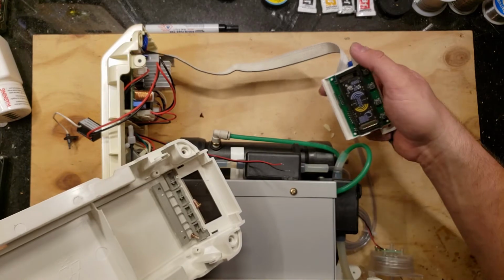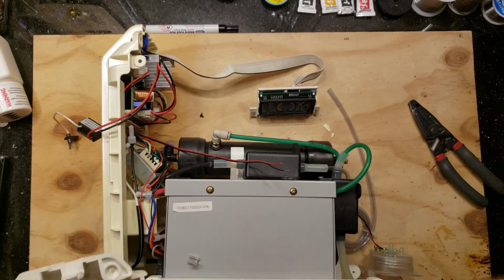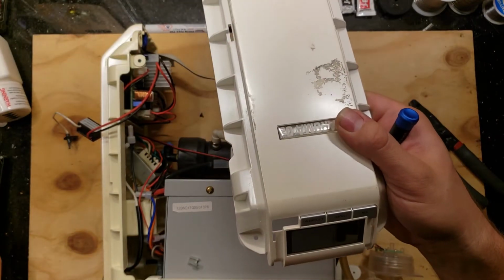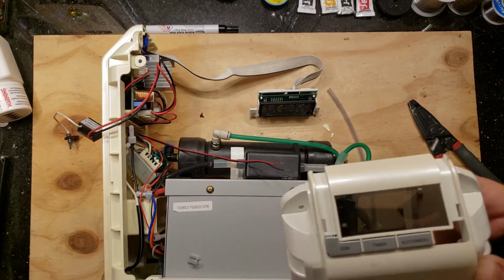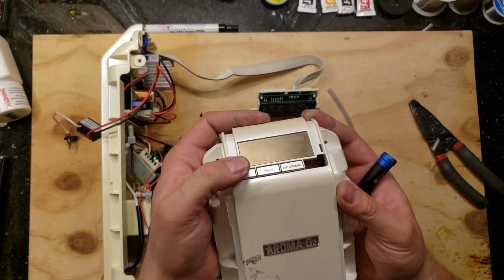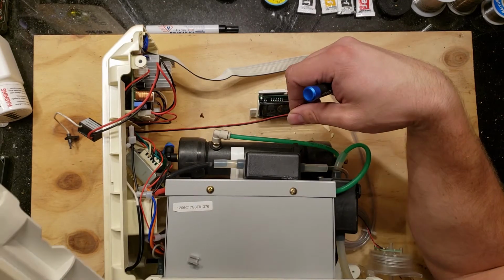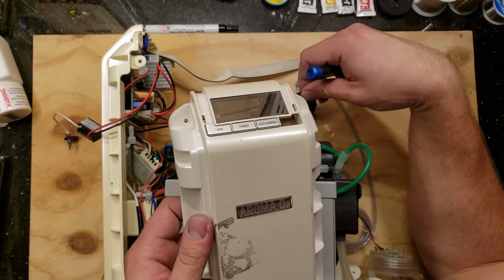Here's the user interface. So the 4 buttons, which one just fell and I kind of lost it. So Ion, Timer, Auto Menu, and Power, none of them worked except for the Ion button, which I think is because of the modification for the coin operated version.